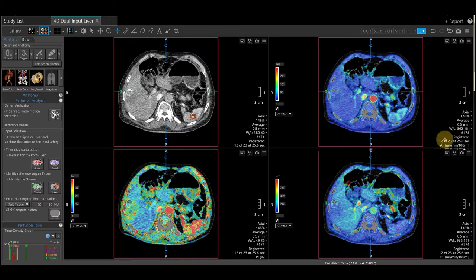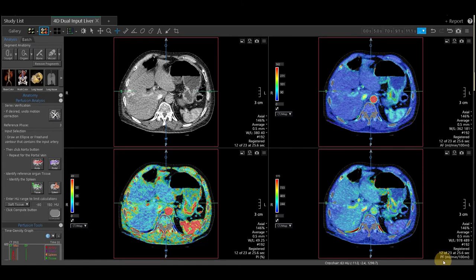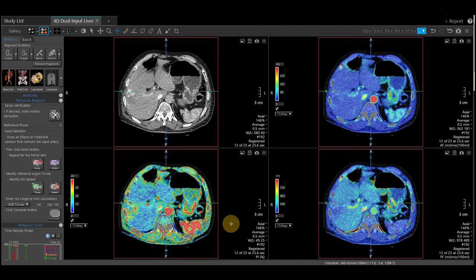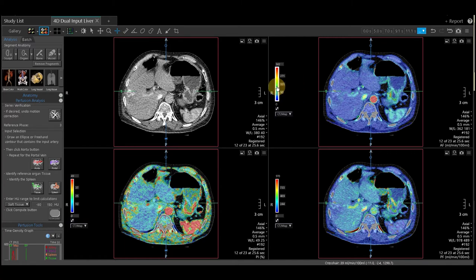On the right hand side, we have our arterial flow map. On the bottom right, we have our portal flow perfusion map. On the bottom left, we have our perfusion index. These are overlaid on our CT image. In each map, there is an icon that we can use as a drop down menu to toggle between the transparencies as desired. We also have the option to change the color scale by left clicking on the color scale or adjust the ranges as needed.